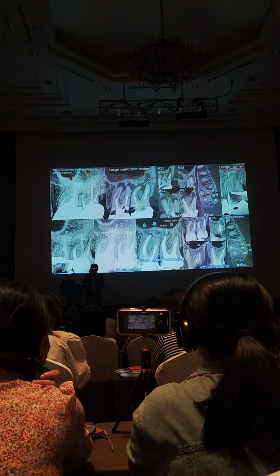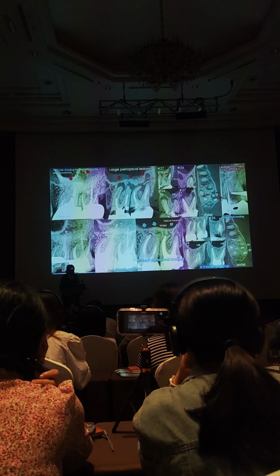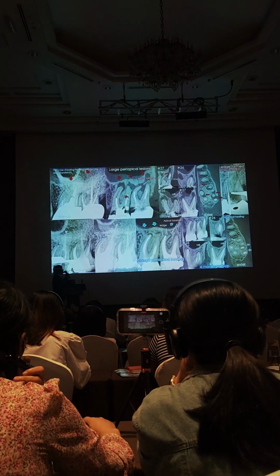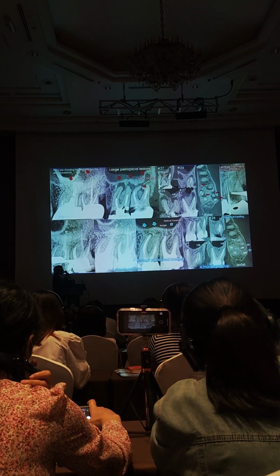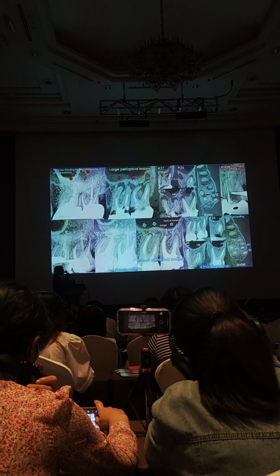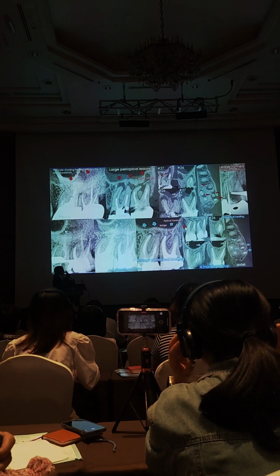So this case is very typical of the importance of the coronal restorations. I was not able to reach the apical one-third of the mesiobuccal root canal, but you see the preoperative lesion here and here, and this is the post-op.